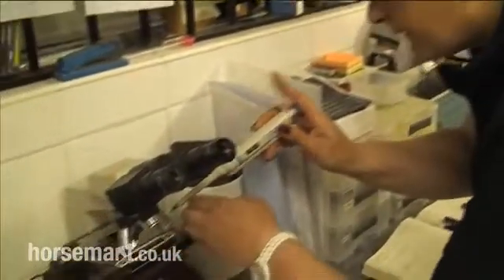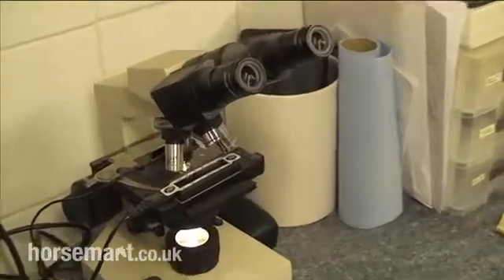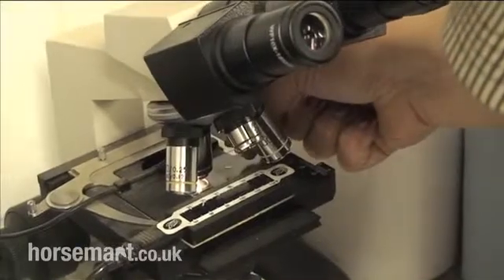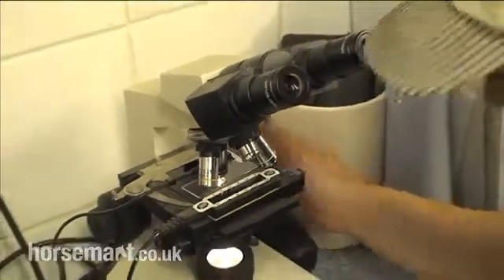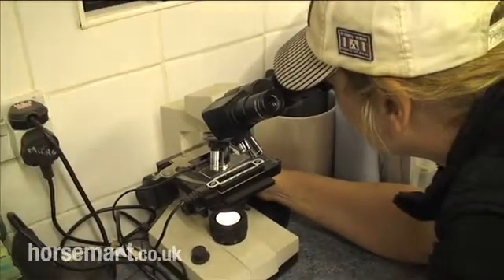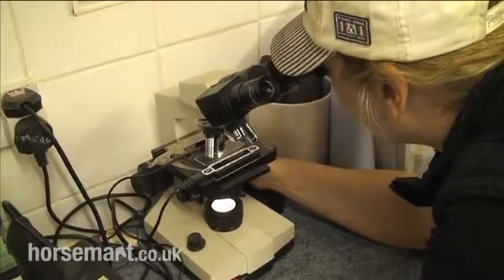She's now placing a small droplet of the extended semen sample on a microscope slide. The microscope stage is heated again at 37 degrees C so that we get a true, accurate picture as to the quality of the ejaculate. We look at it down the microscope and work out what the motility of the sperm cells in the ejaculate is.